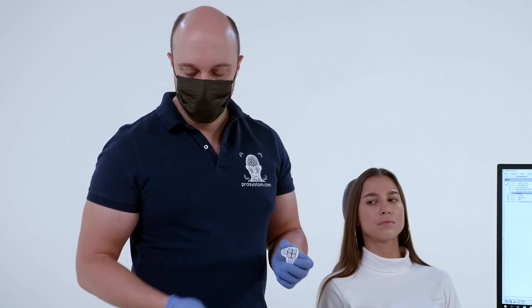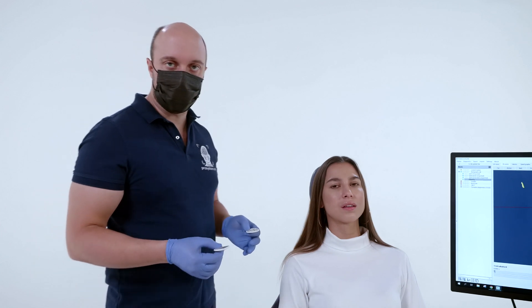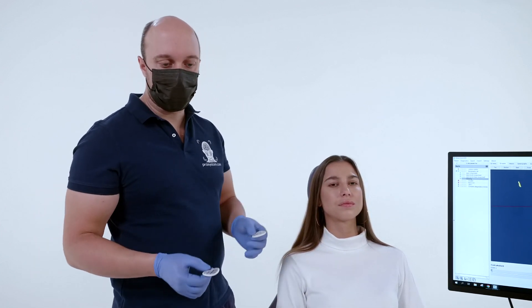Markers are fixed to the dentitions according to a certain algorithm. The marker on the upper jaw is fixed to the teeth in the first segment of the dentition. The marker on the lower jaw is fixed in the third segment of the dentition.